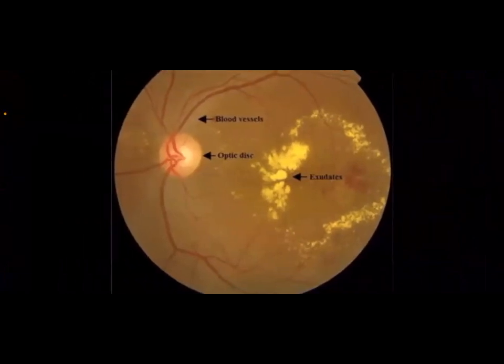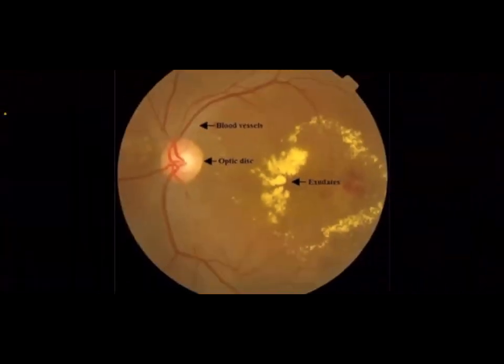Are you able to see my screen now? Yeah, this is what you are going to see if you ask the patient to look into the light source. If you did not see maculopathy before, you will think that your light is reflecting back from the retina. Just reduce the intensity of the light, it will not change. So this is yellow exudate affecting the macula. The patient has got maculopathy, diabetic maculopathy. Okay.